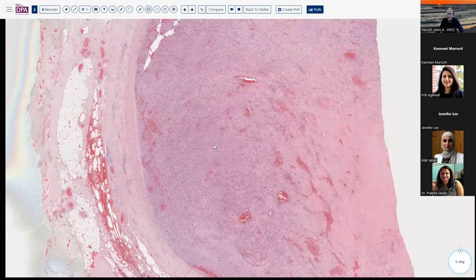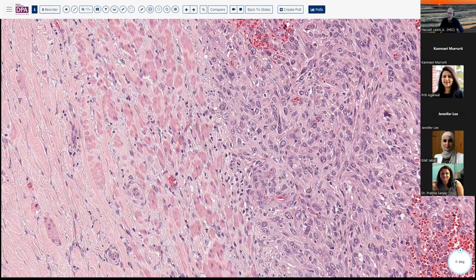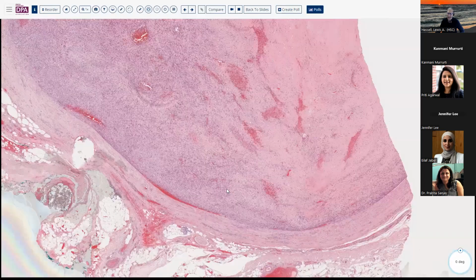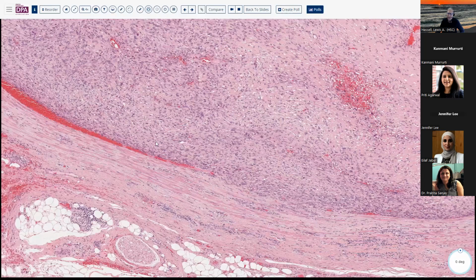Now, this is a lesion that is actually occurring inside a structure that includes some muscle. I don't remember the exact story of this, but it certainly illustrates the fact that there are occasionally intravascular versions of this tumor or intracavitary tumors. But I think this was actually one that was an intravascularly derived tumor.